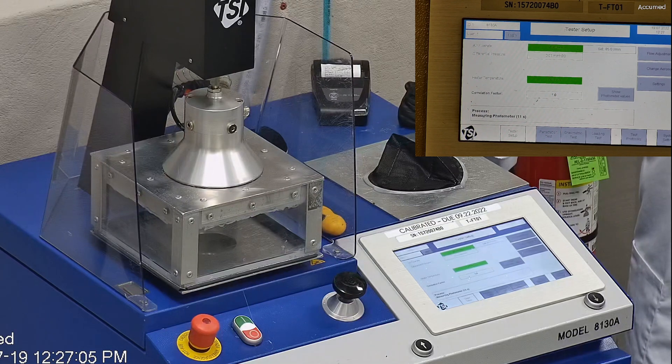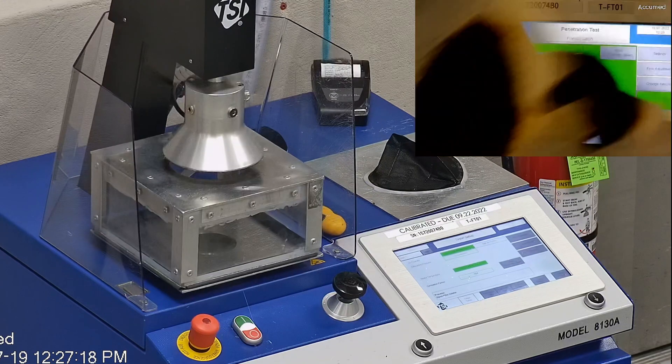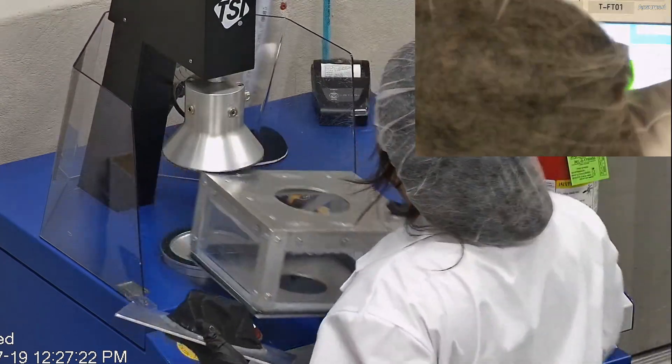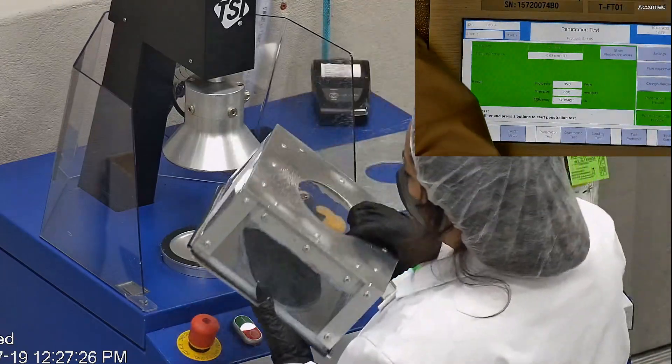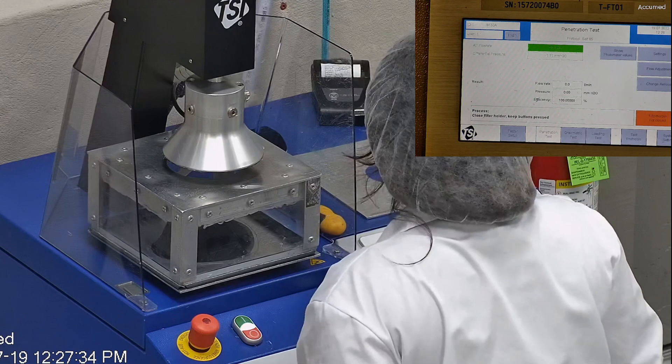The testing plate is then attached to the frame and the box is placed under the TSI filter holder for testing. The results are displayed on the TSI monitor. F stands for airflow rate, which we test at 85 liters per minute. R is for resistance, also referred to as pressure drop, which correlates with breathability — so the lower the number, the more comfortable and breathable the mask is. E stands for filtration efficiency percentage.